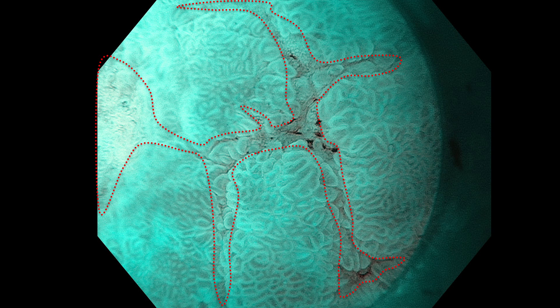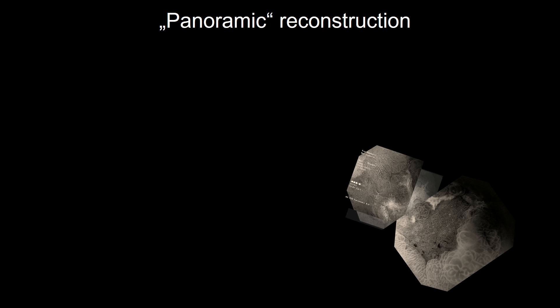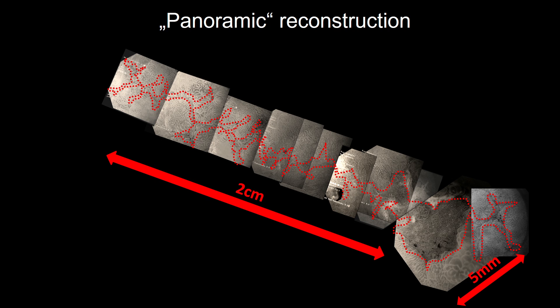So G3 cancer was suspected. I performed a panoramic reconstruction of the major lesion. Using the gastroscope, slowly moved to the proximal side and took pictures, then the distal side. We see that the clear margin of the major lesion is twice bigger than before — 2 cm proximal additional margin and 5 mm distal.